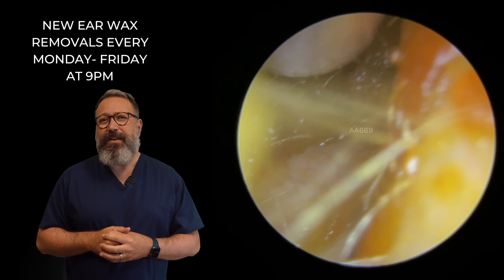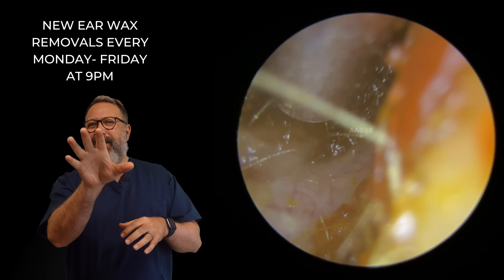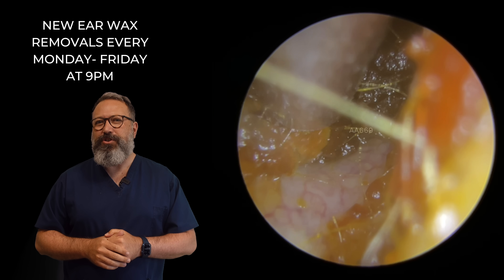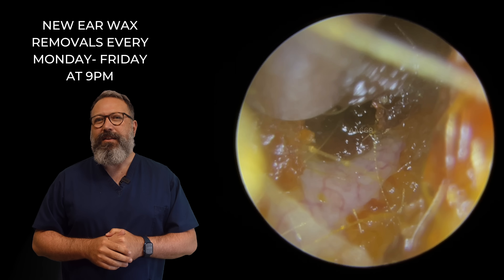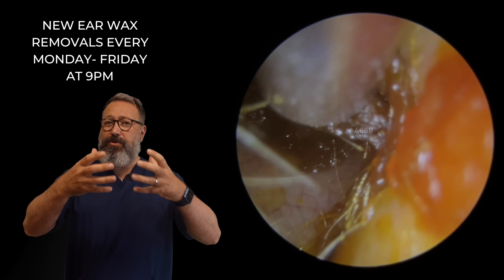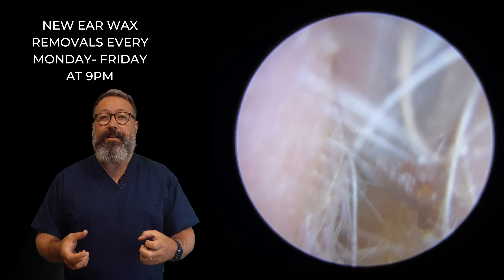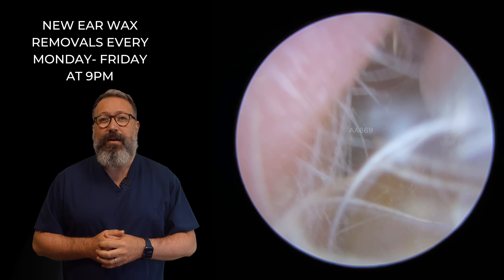So we're just chipping away here at the outside edge. You can see these are the pieces there to the right-hand side. You can see just past the suction tube there, another section of wax. We're just getting through the little cilia here on the outside part of the ear. And as we're drawing this suction down the canal, it's starting to pick all these little bits up that are off on the canal walls as well. So it's coming away really, really well.